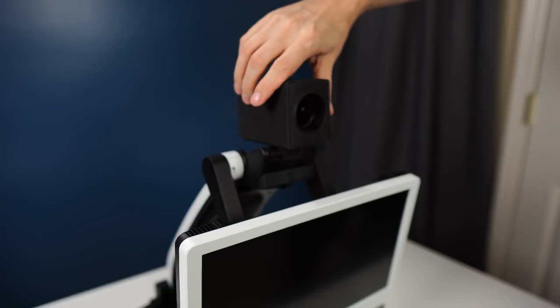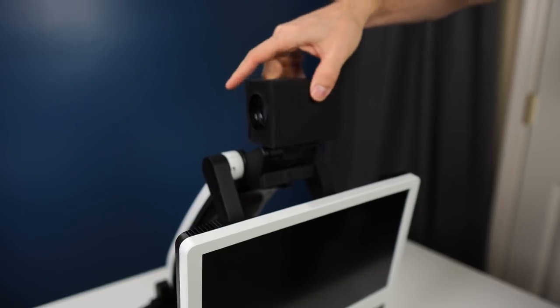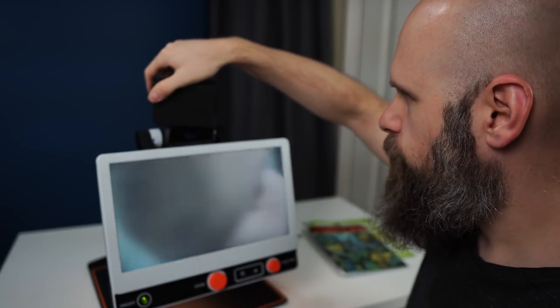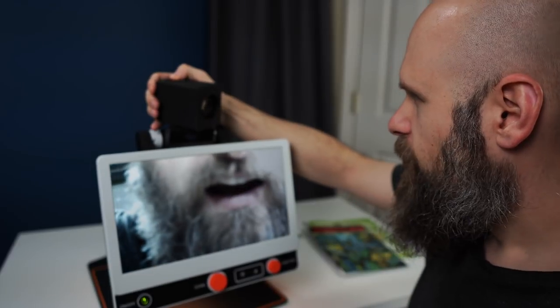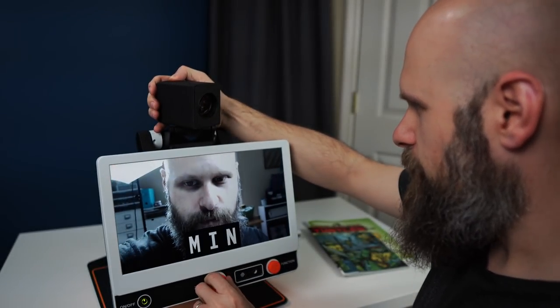This also has distance viewing. The way that works: all we do is lower down our screen and then pop up our camera, rotate it, and this camera can swivel all the way around — whatever direction you want to point it at.